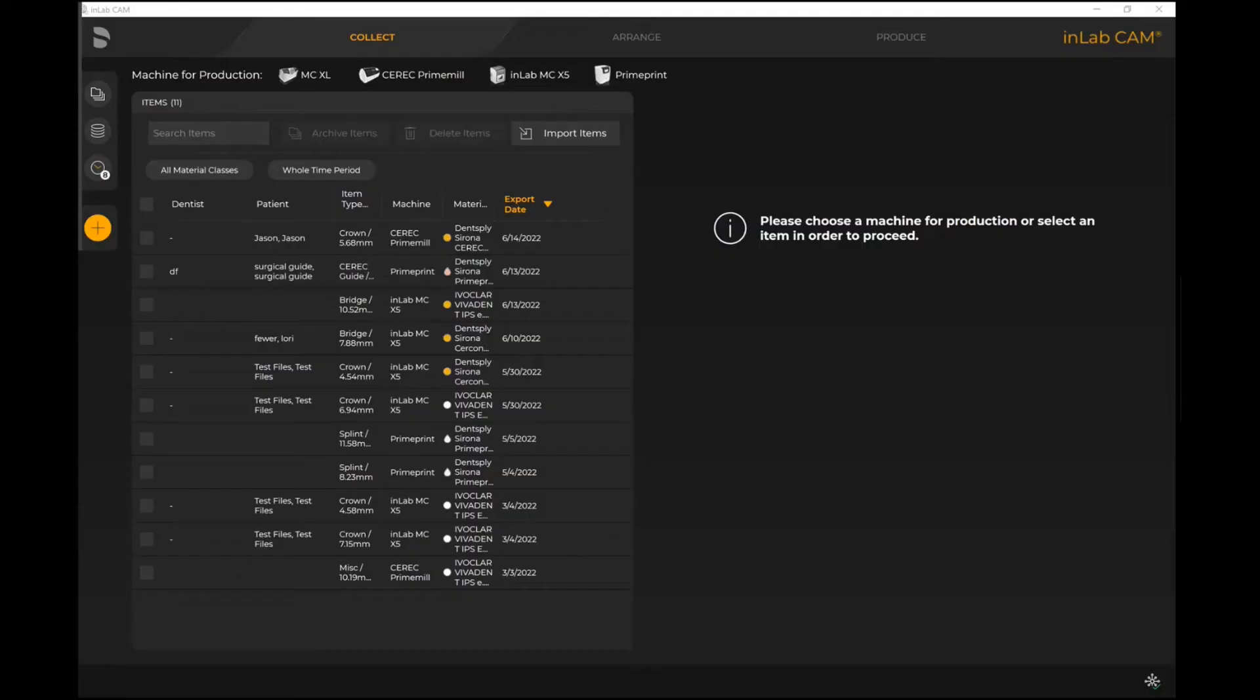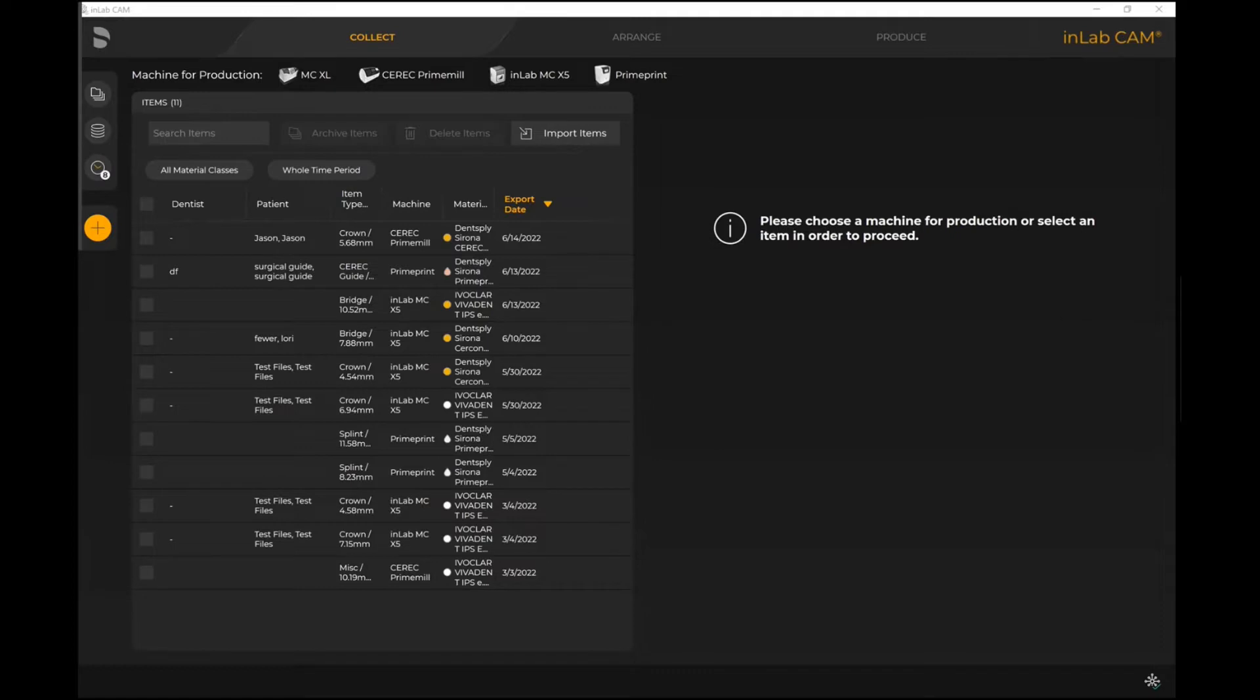Hello and welcome. Today in this video you will be taken through how to import files into the inLab CAM software when you are working with third-party design software. When you first come into the inLab CAM software, any machines that are available for you to utilize will show up.